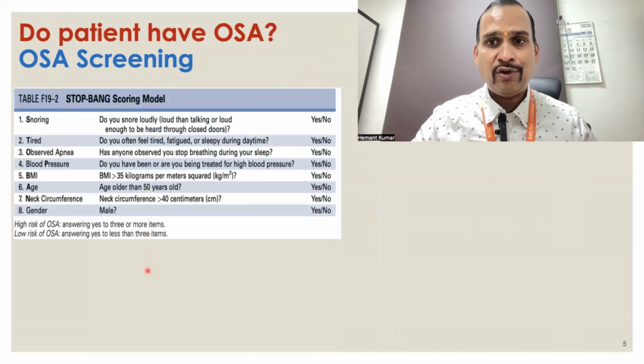Okay. So I'll tell you about these sensors in brief. First, we attach EEG, electroencephalogram. We have to see at least three leads, one from frontal F4, central C4, or occipital O2, and these are the backup leads. Along with these three leads, we have to attach a lead on the mastoid.